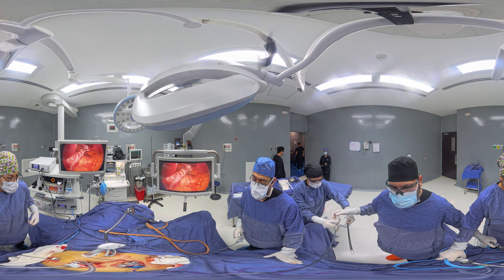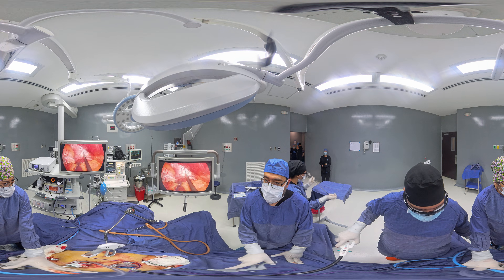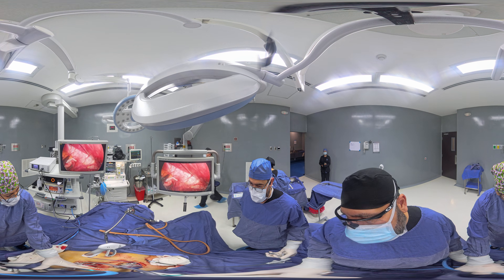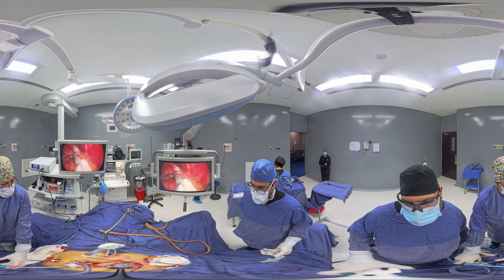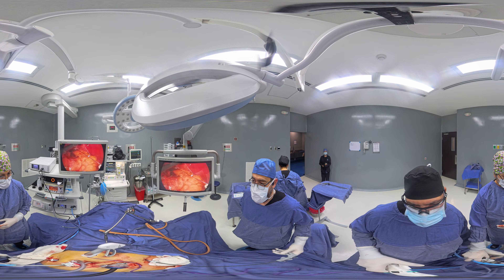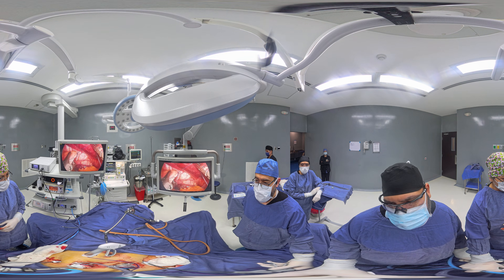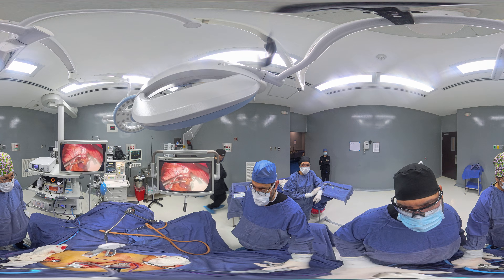In our case, we like to introduce a suture — a 2-0 absorbable suture — with this instrument called the endostitch. What we'd like to do is reinforce the staple line. By doing so, it is proven to lower any post-op bleeding, and it just takes a couple of minutes. We believe it is truly worth it. That's the beginning of the suture; we go side by side all the way down to where we started stapling.